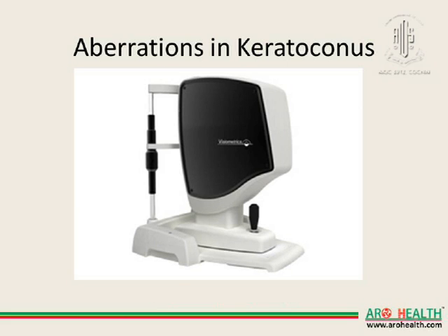How do you objectively show this? You have told the signs to the patient and the patient doesn't agree with you. The patient says, I don't care, just tell me how to do it. How do you measure aberrations? You can measure aberrations by using any of the aberrometry techniques: ray tracing, dynamic skiascopy, or a double pass technique.